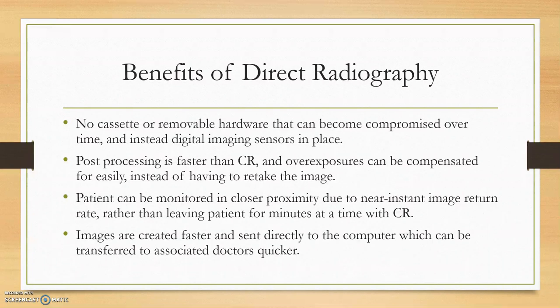And then there's no cassette or removable hardware, and post-processing is so much faster than CR. Exposures can be compensated for. Patients don't have to be left while you go and read your latent image on the cassette. DR takes care of that for you, and you can view the image instantly. And the images can be transferred to the associate doctors much faster.